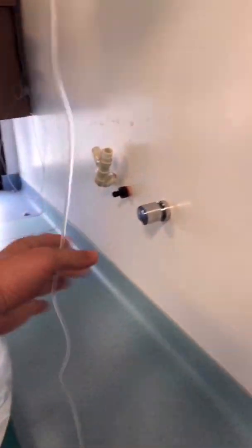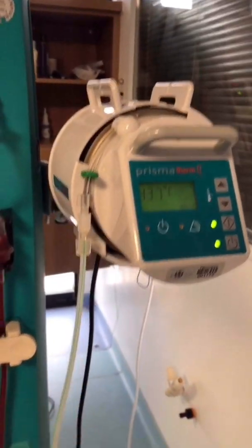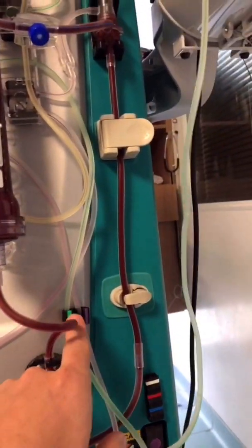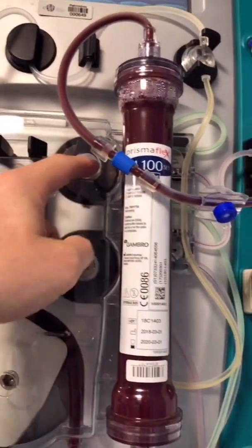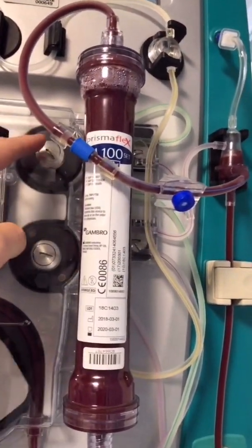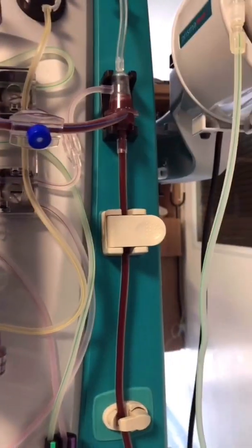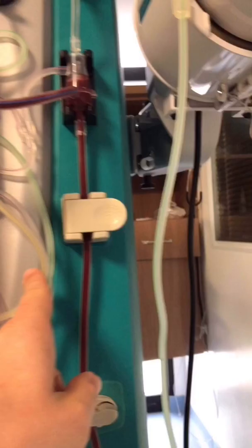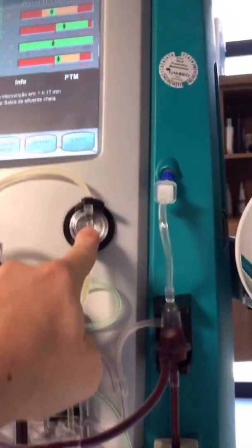The green dialysate line should go from here up to here, then into the warmer, going down, passing through this green port, and going up. This is the dialysate pump, which runs faster than the substitution replacement solution pump, and then the fluid goes into the filter.